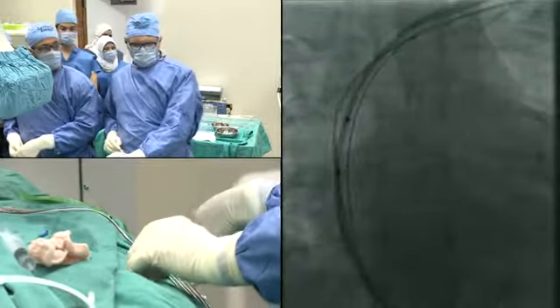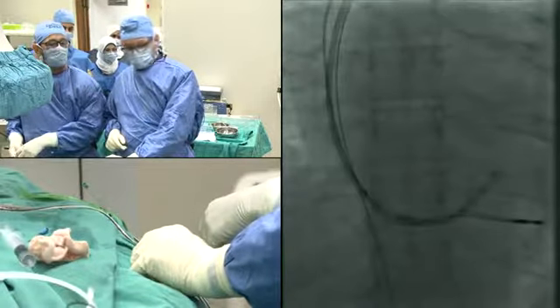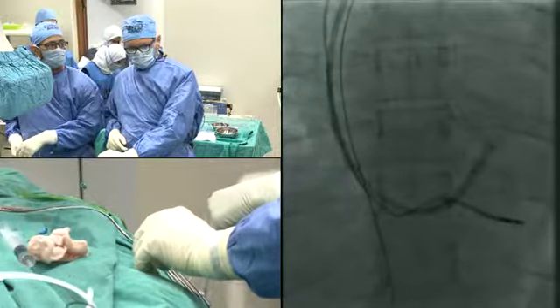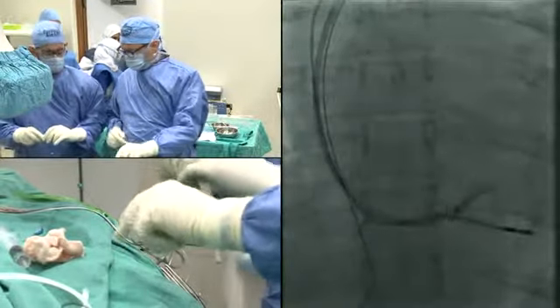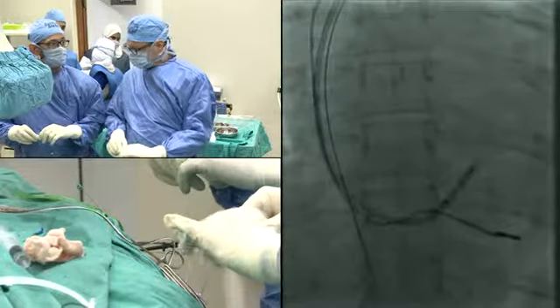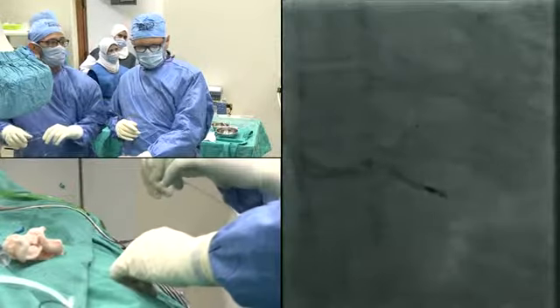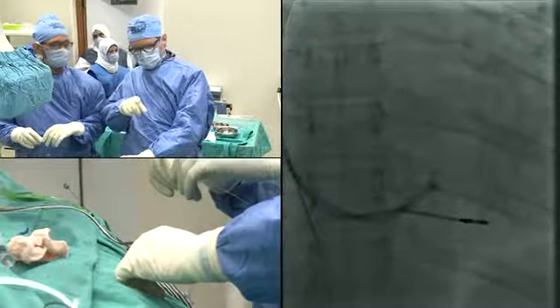Which vein would you prefer? Can you bring us the road map? Which view? Now, which is this wire that you're using here? Nice, directly into the wire. Okay, the posterior. Do you prefer the other branch, the smaller one? No, this branch is good.